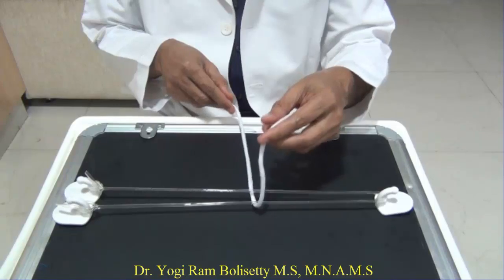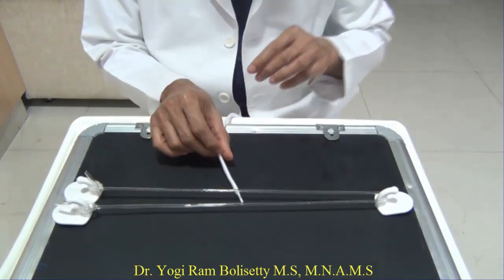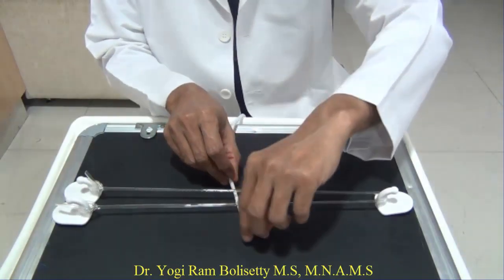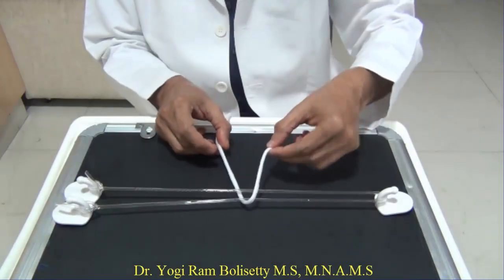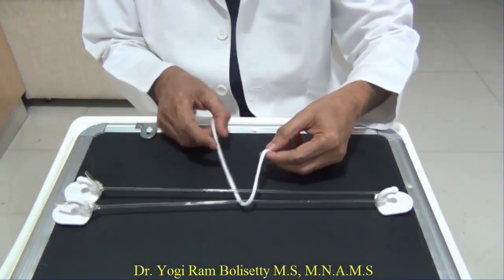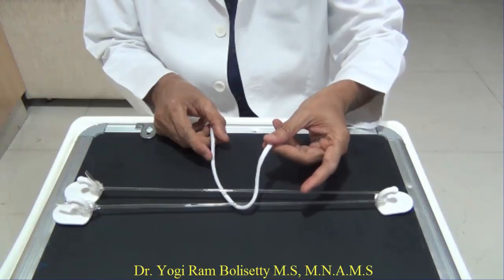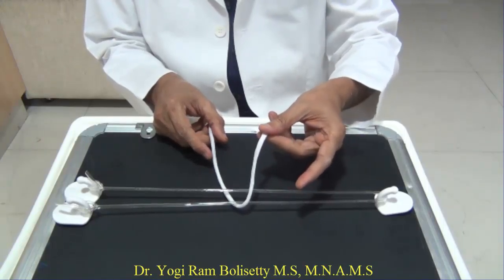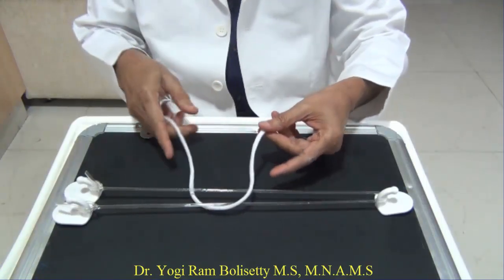So now I will demonstrate to you the method of making the reef knot. First, pass the strand below the tubes. Grasp it in the fingers of your left hand. So hold it between the thumb and middle finger of the left hand. The long strand should be in your right hand.